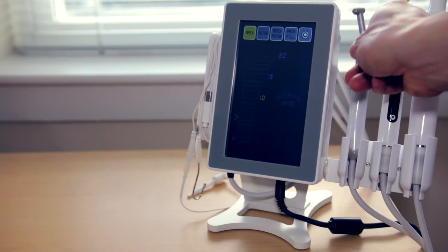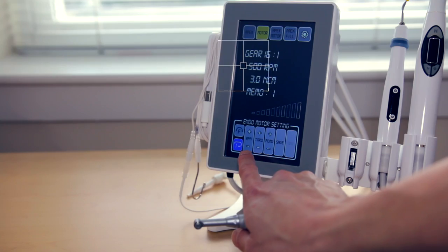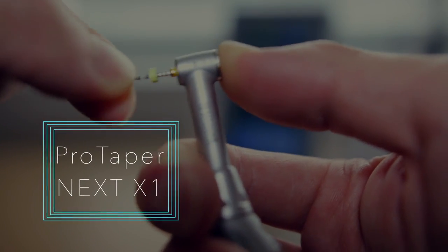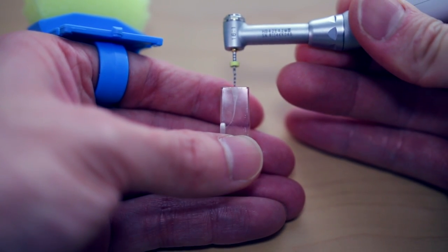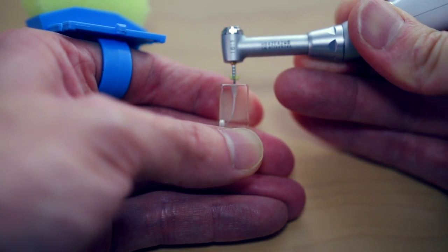Once the glide path and working length are found, I click the button on the touchscreen to change to the motor setting. My favorite settings are 500 RPMs with about 1.0 Newton centimeter torque limit. I start with files that are more crown-down in method, such as the Pro Tapers. My first one is the Pro Taper Next X1. What I like about the X1 is that it starts coronal cutting from the crown down, but it's also flexible enough to recreate the glide path started with a hand file. The movements I use are in-and-out pecking motions to get down to the apex.